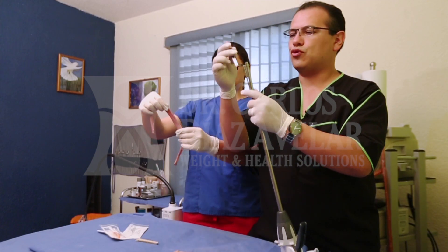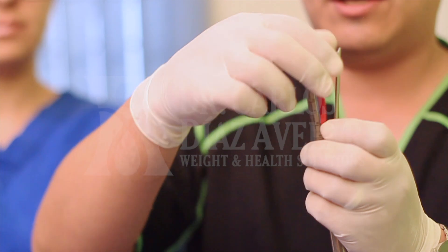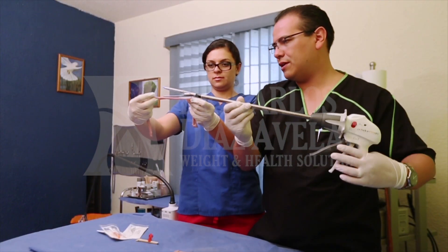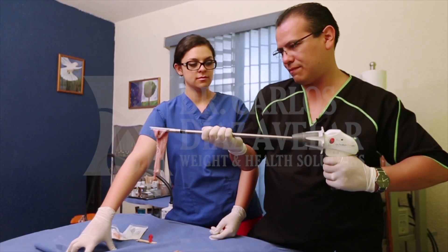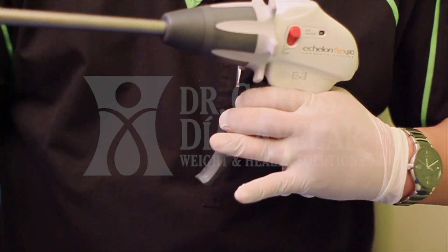He is going to place the new stapler until we hear the click. He takes out the safety, and then he is going to staple. This kind of device works for bariatric surgery and intestinal surgery. Again, the first click, the second one, and the third one.